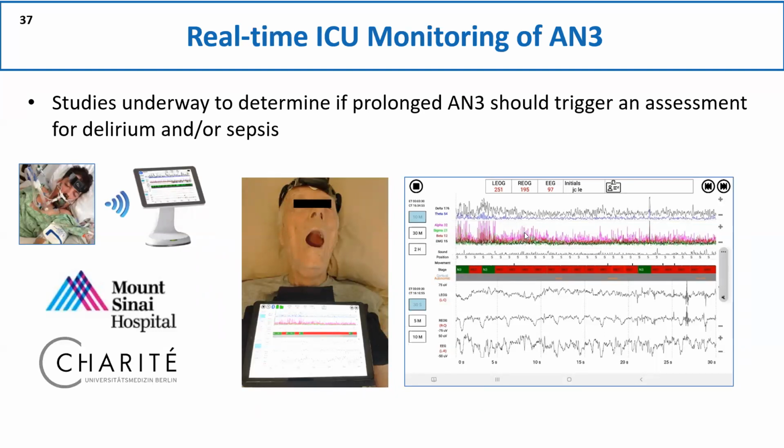So you can imagine if you were doing rounds looking at patients who were asleep or were supposed to be asleep in an intensive care unit, you could flip back fairly easily through the night, looking for possible periods with sepsis-associated encephalopathy, non-convulsive seizure activity, and so on.